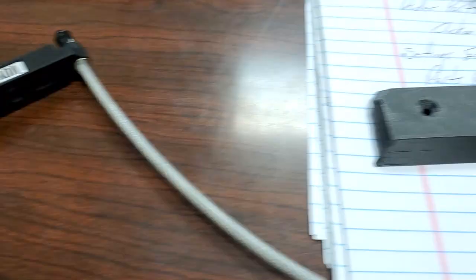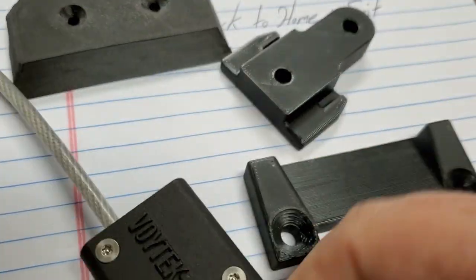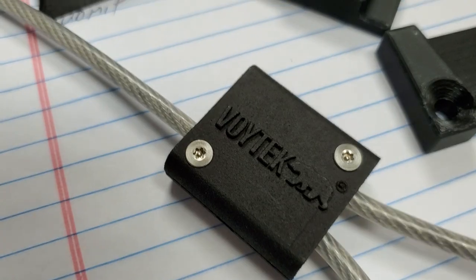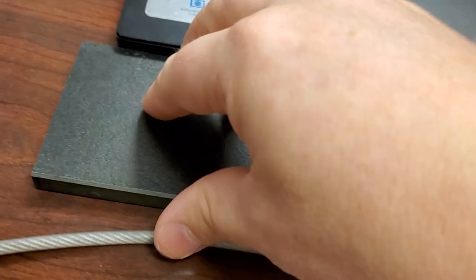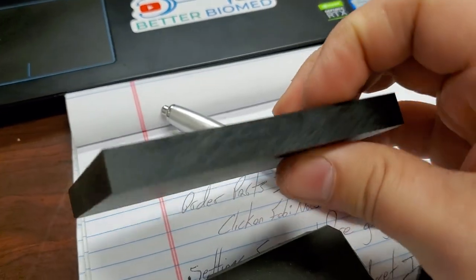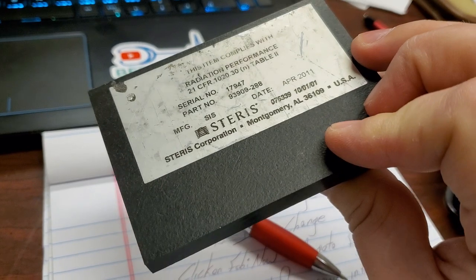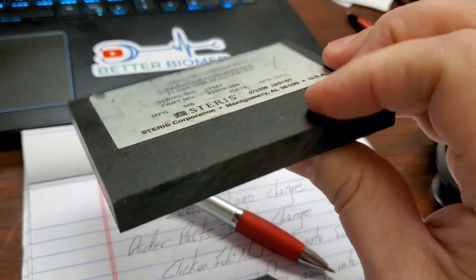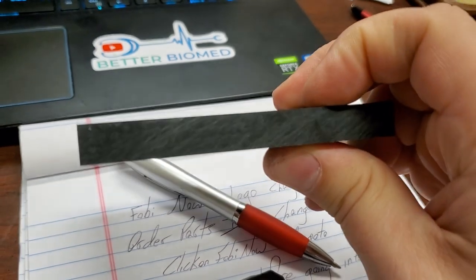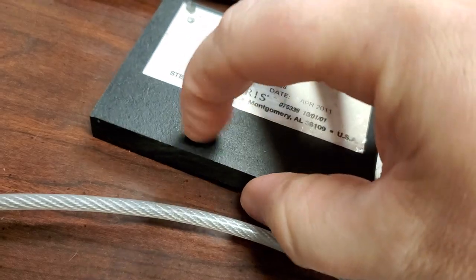The density is really high on this plastic, so I assumed it was some sort of new carbon composite. This here is an example of a carbon composite — you can see the cross structure inside it. This is actually a piece from a surgical table; you can see it right there. This is a cross section of a platform on a surgical table, and it's extremely dense.